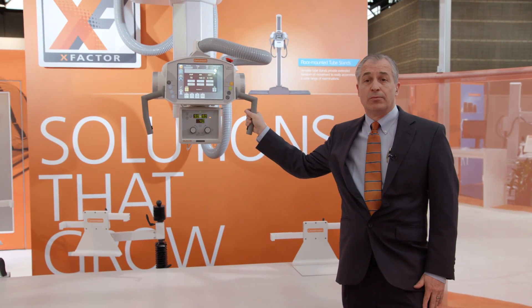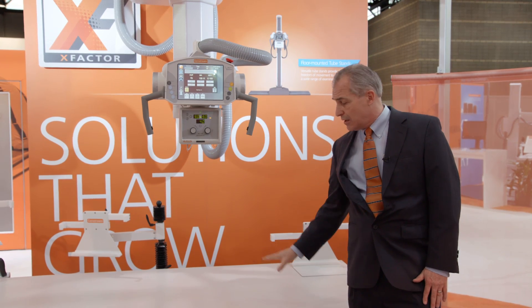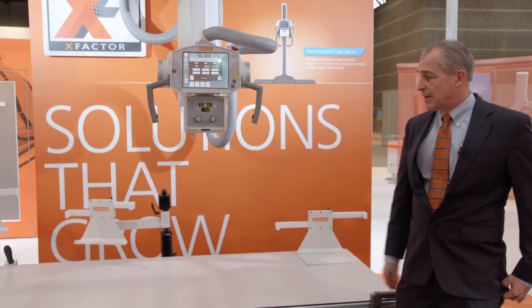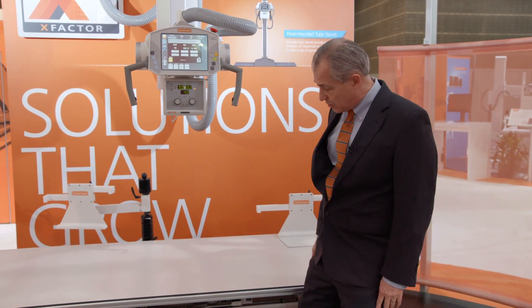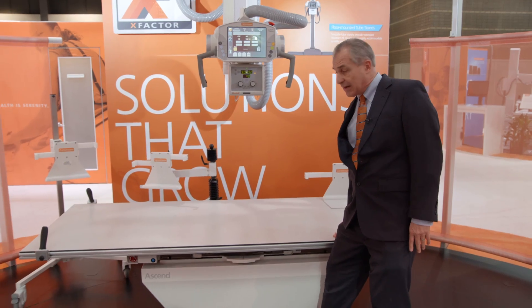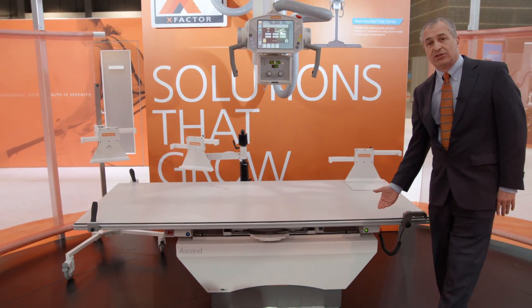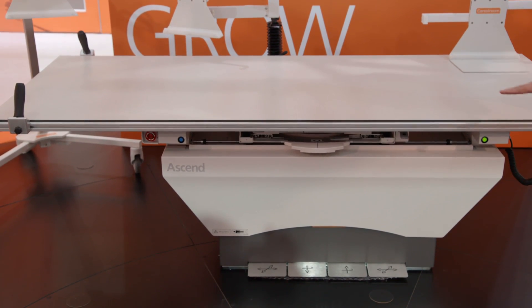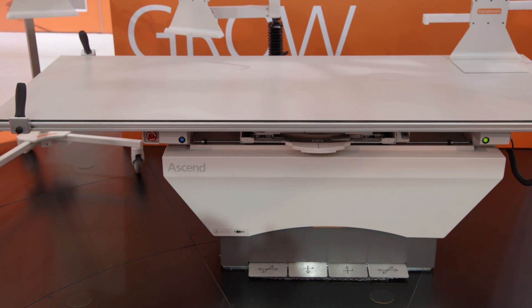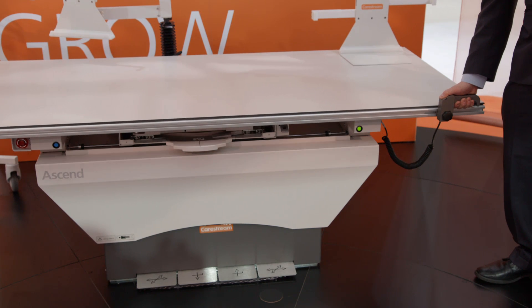It's got all the normal features. There's an overhead tube, and you can also get this with a floor-mounted tube, table, and wall stand, which I'll talk about in a minute. The table has all the normal options — it's got float capability, goes down to about 21-inch height all the way up to 28-inch height. You can float with the foot pedals, or you have a hand grip that allows you to elevate or float the table.